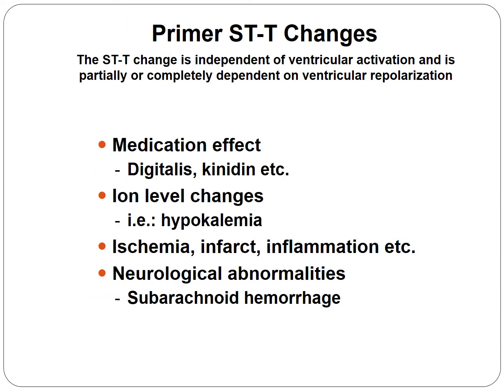The primary STT changes are independent from the ventricular activation and are partially or completely dependent on the ventricular repolarization. These can develop due to medication, Digitalis, quinidine, ion changes such as we discussed in hypokalemia, ischemia, infarct, inflammation, neurological abnormalities such as a subarachnoid hemorrhage.